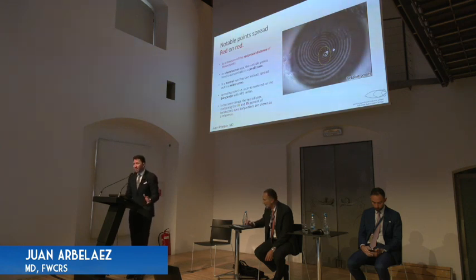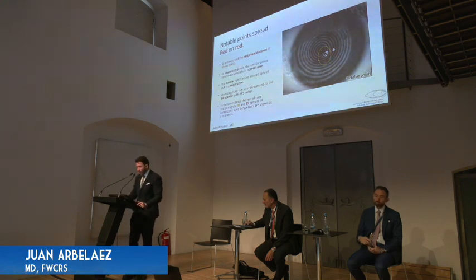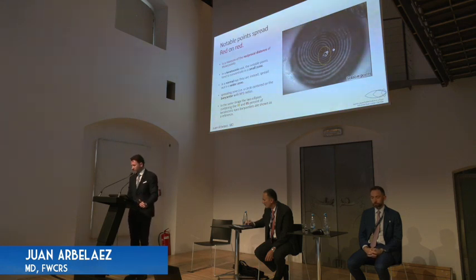We always have 2 fixed rings, as you can see, the yellow and the red one. The yellow represents where 99% of the patients with keratoconus are expected to have the center of the keratoconus, and the red represents 95% of the patients with keratoconus are expected to have the center of the cone.